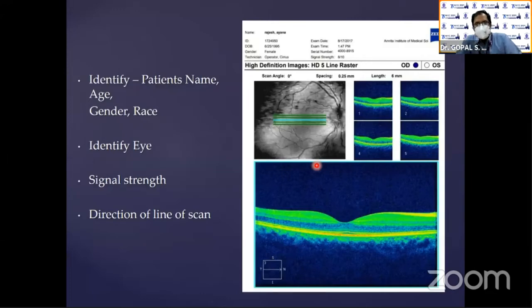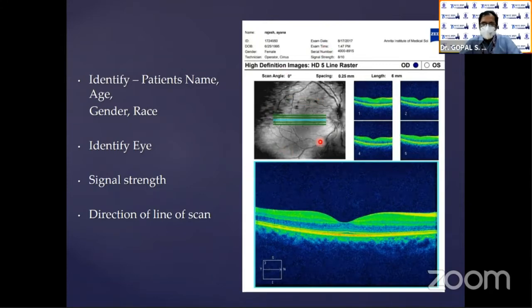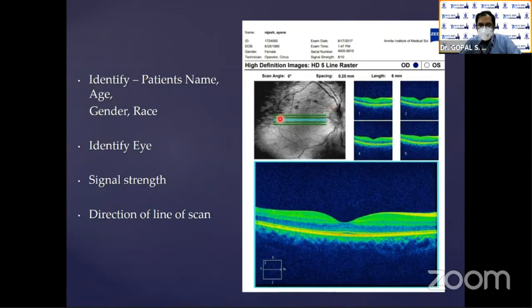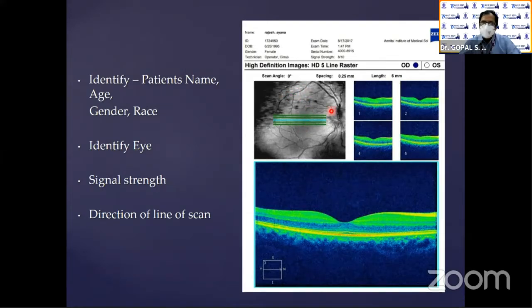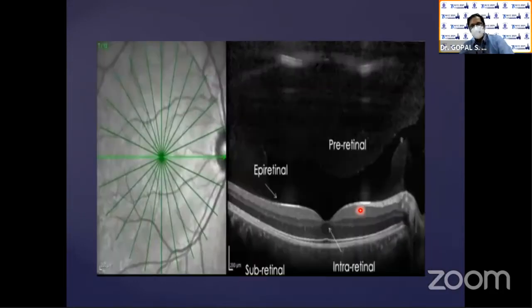We should always look at the patient's name, age, gender, and probably the race. You should look at the eye that has been scanned and the location where you have scanned — if the location is not in the center, it may show an edema, but that doesn't mean there is a central edema. So the location, the signal strength, and the direction — all these we need to look at.